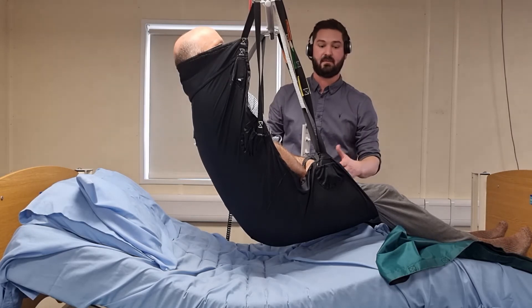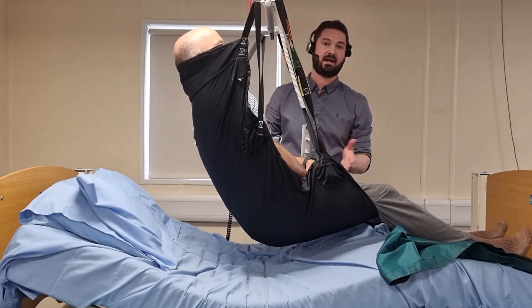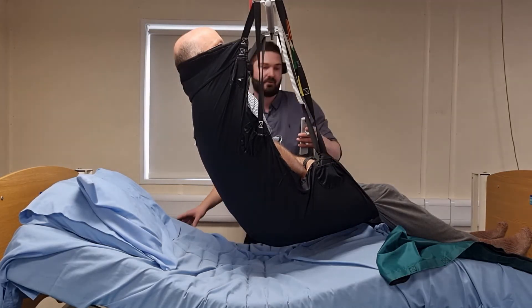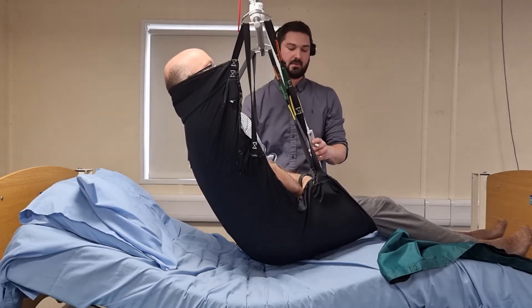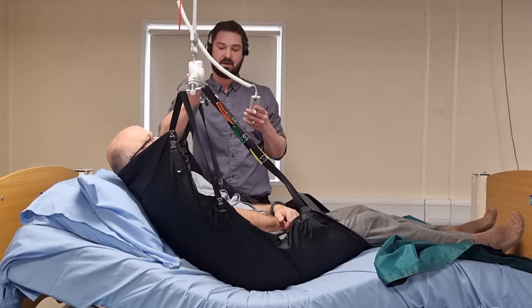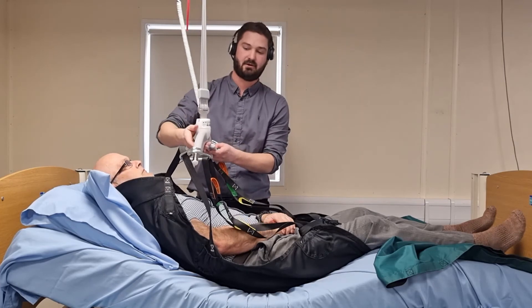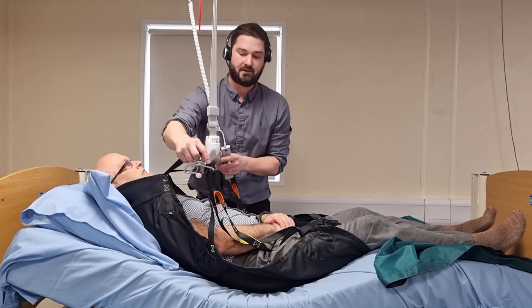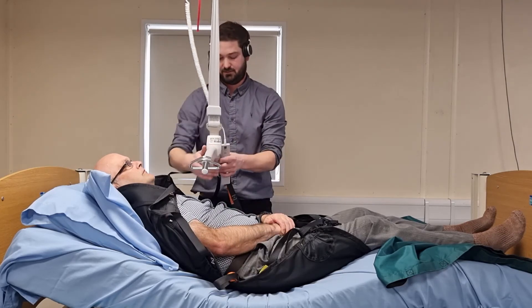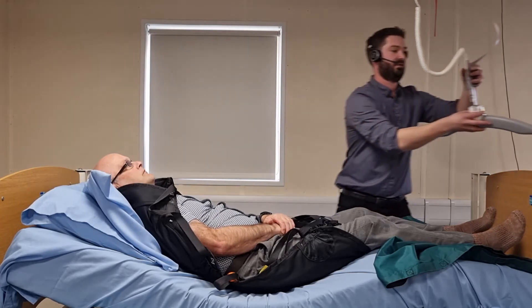That is the in-situ sling after it's been used to hoist someone up off the bed. I'm now going to demonstrate how to remove the sling in a lying position. I'm going to lower back down onto the bed, being mindful again of the carry bar. Once you've got slack on your tapes, you can remove these. Once they are removed, the hoist can be taken away.